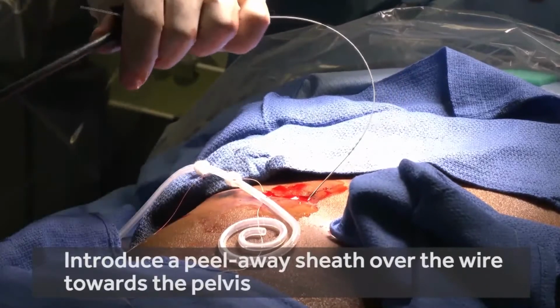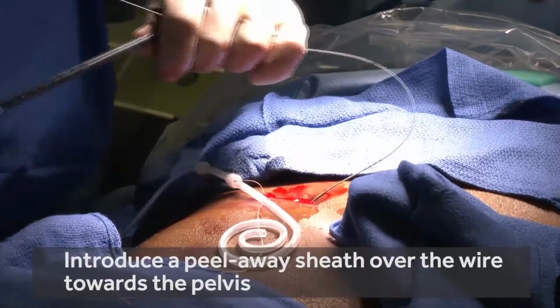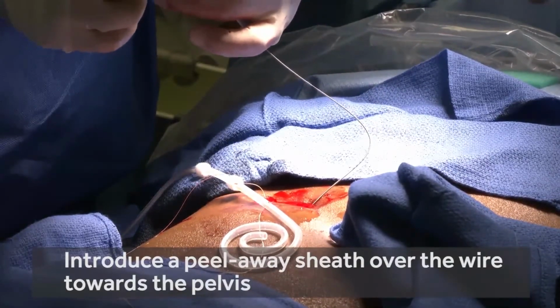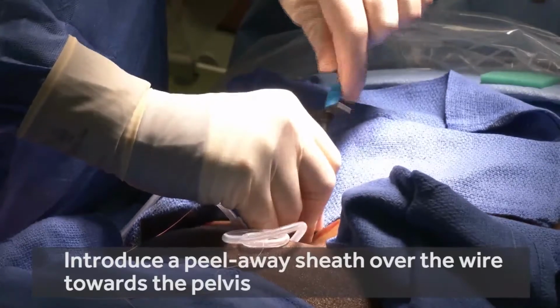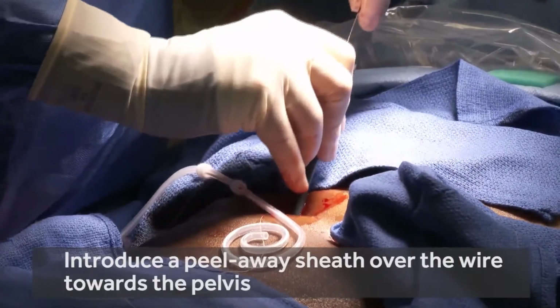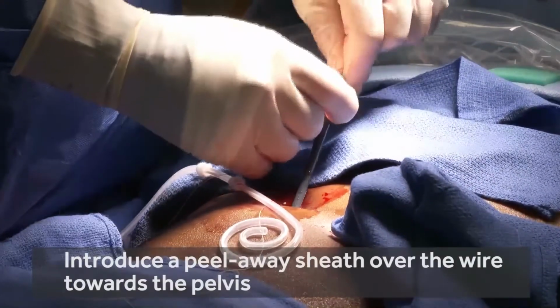Now we'll place the peel-away sheath, and depending on how the patient is doing, we may ask the nurse or the anesthesiologist to give another round of sedation because the peritoneum is so sensitive. But in general, we do these with monitored anesthesia care or modified sedation.